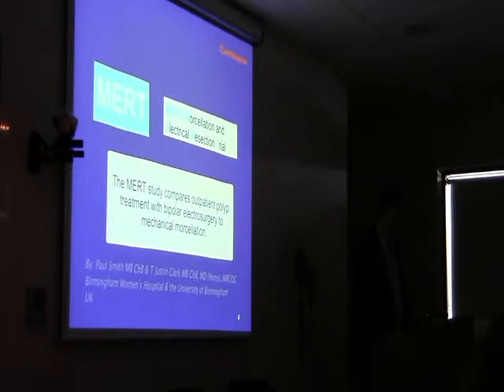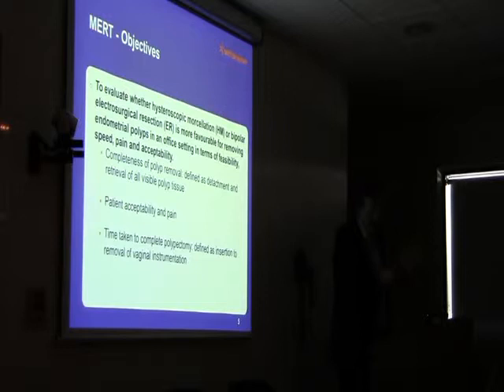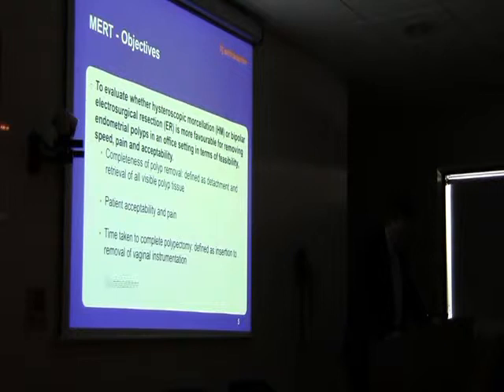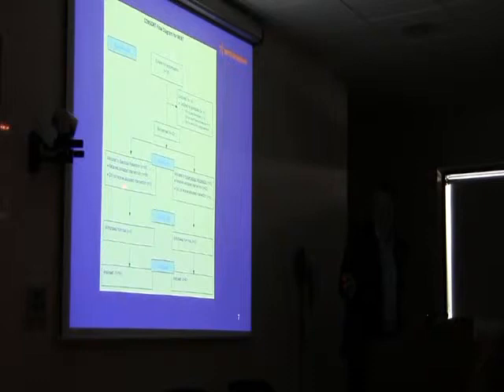So that paper's just come out, and what we did, very quickly because I know we're getting tired, was we've already done a big study, the op trial on effectiveness in terms of treating symptoms, the data of which will come out. But in this case, we're just interested in the feasibility, safety, acceptability, pain scores, and completeness of removing the polyps. So we randomised women, allocating them to the morcellator or to resection. We had no withdrawals.